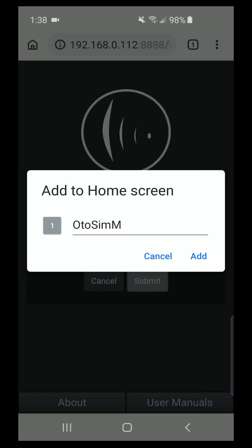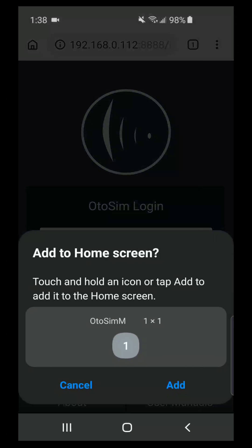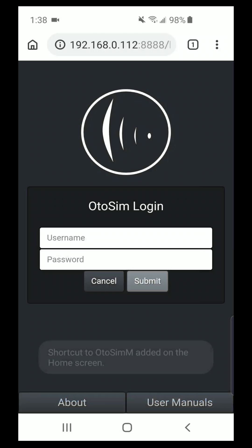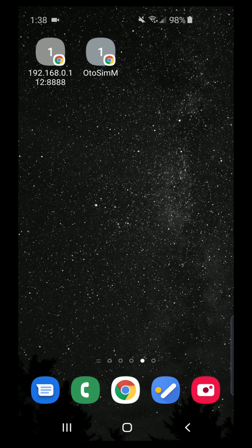This will be called Otisim Mobile. We'll add it to the home screen. It says the shortcut has been added. We'll close this down, and now we will launch the program from the shortcut on the desktop — the Otisim Mobile.